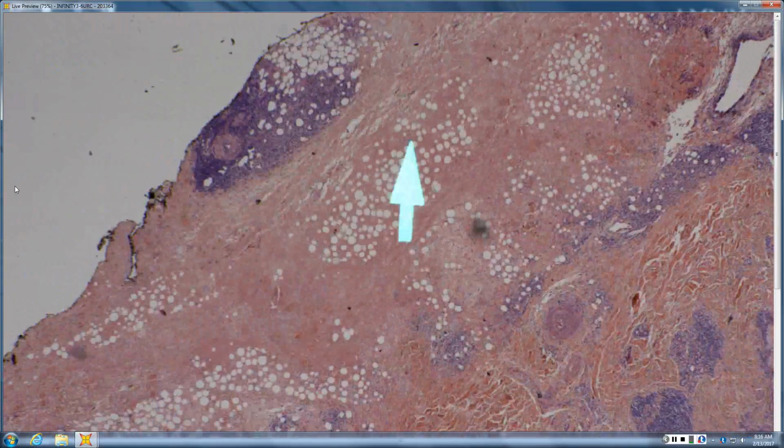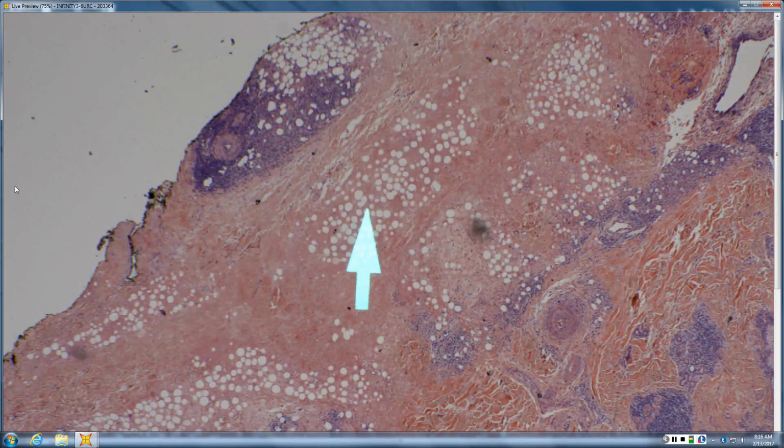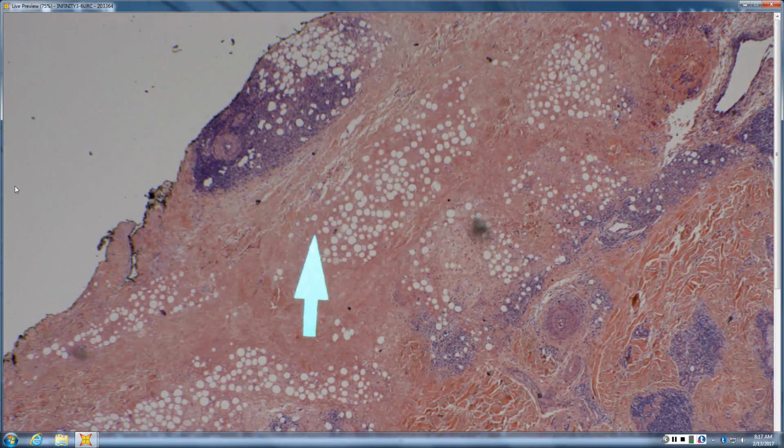Tell me about the fat. It's definitely having some necrosis to it almost, like the septa are enlarged, but you're also getting more of that chicken soup type of lymphocytosis. So instead of all the circles being the same size as in a septal panniculitis, the circles are different sizes, suggesting a lobular panniculitis, and it's intensely staining red. What is that intensely staining red stuff? The fibrin. So you have a lobular panniculitis with fibrin and nodular lymphoid or lymphoplasmacytic islands, like lupus panniculitis. Lupus panniculitis, very good.